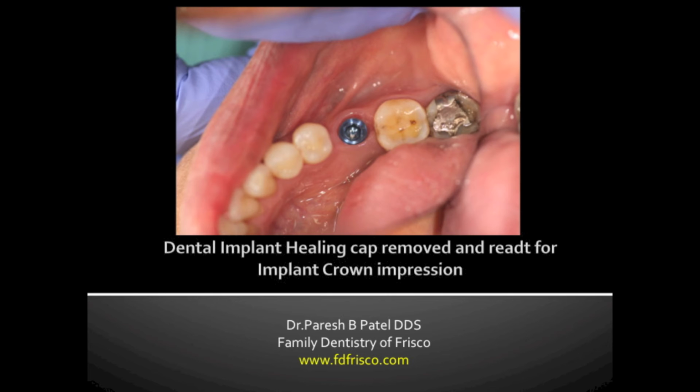You can see very good tissues, look very clean, and that blue component that you see in the patient's gum is the dental implant. This is a stage at which we would take the impression that would allow us to place the dental implant crown on the patient's tooth.